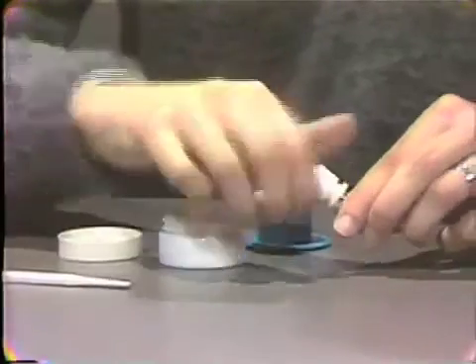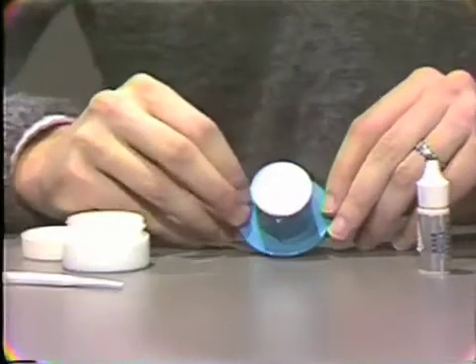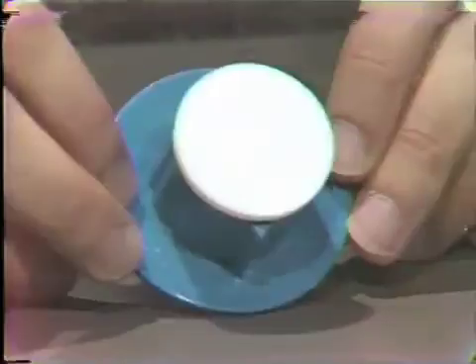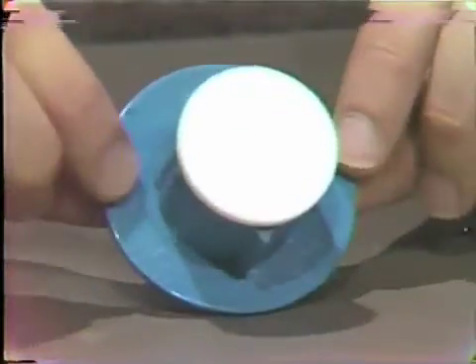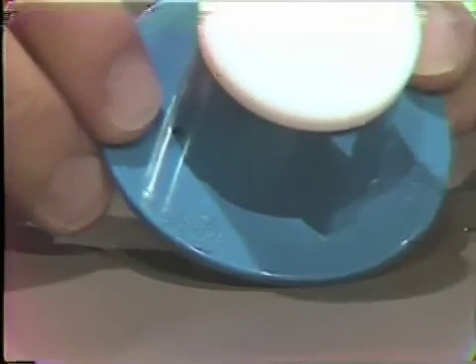Unique to the Kerr system is the Smilometer, which serves as a mixing pad and dispenser for the paste. There are three positions on the Smilometer. The first position indicates dispensing for a small amount of paste. The middle position is the mixing position, used for a large and small mix. The third position provides for the dispensing of a large portion of paste.